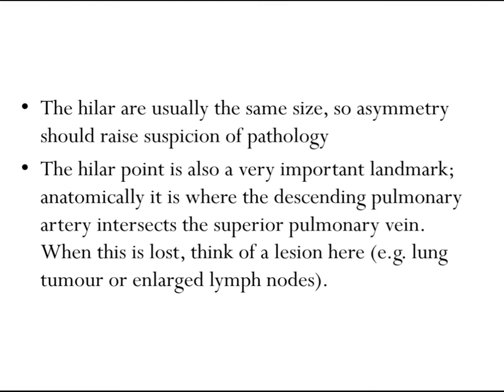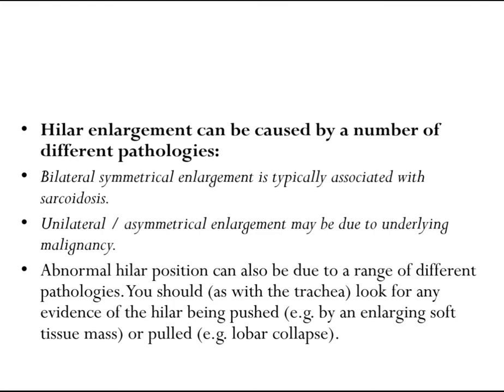The hila are usually the same size, so asymmetry should raise suspicion of pathology. The hilar point is an important anatomical landmark where the descending pulmonary artery intersects the superior pulmonary vein — when this is lost, think of a lesion such as a lung tumor or enlarged lymph nodes. Hilar enlargement can be caused by various pathologies: bilateral symmetrical enlargement is typically associated with sarcoidosis, while unilateral asymmetrical enlargement may be due to underlying malignancy. Abnormal hilar position can also result from a soft tissue mass or lobar collapse.